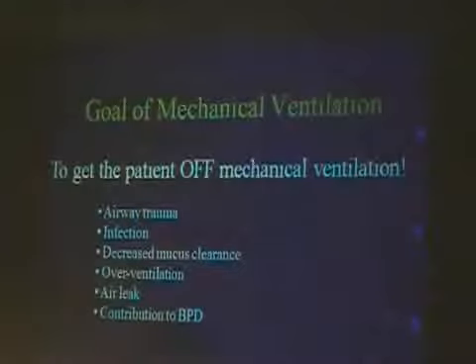The goal of any mechanical ventilation is to get the patient off of mechanical ventilation. That is our primary goal, because mechanical ventilation contributes to a lot of badness. This includes, as we've talked about in some of our recent lectures, airway trauma, infection, decreased mucus clearance, overventilation, which is a huge issue that we will talk about more, contribution to air leak, and also contribution to BPD.